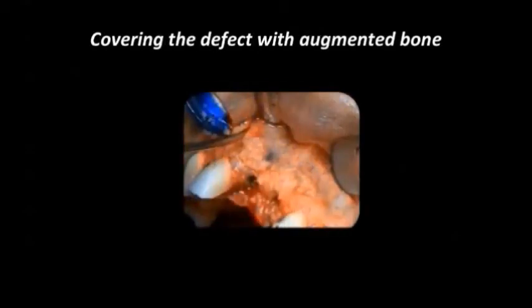As you can see, the first implant had been placed, the first part of the bone has been placed on the first implant, and then we did the second implant, and I'm going to leave this little gap between them in order to mimic the root formed shape in that area.